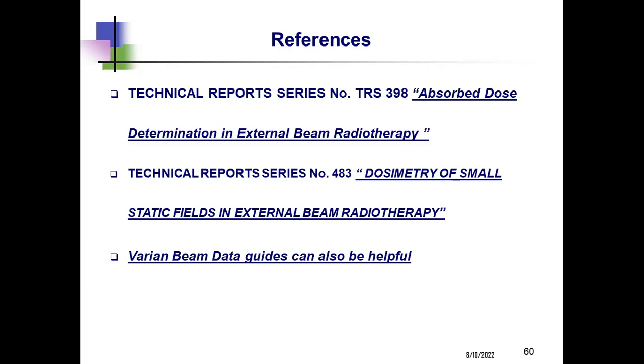We have another question from Muhammad Abu Bakr. Yes, I read that. ASCII is the only way to download calculation up to our TPS, depending upon the system you are having. But in our system, what we have right now, they required the ASCII format. So the dosimetric software automatically converts it into the ASCII format. We just need to give a command and it will be converted.